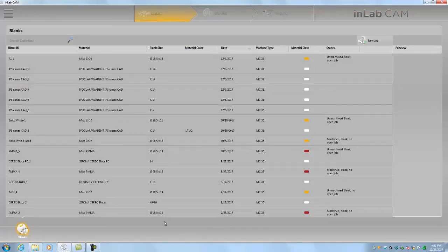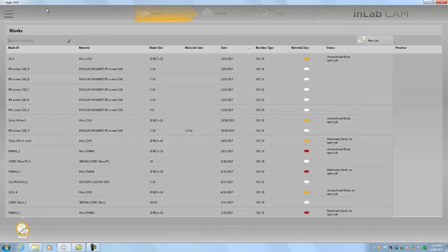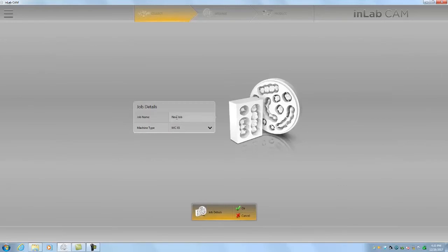Here we are in in-lab and we're going to start a new job. I'm going to give this the name 3-shape demo and we're going to keep this on the MCX5 for this test.